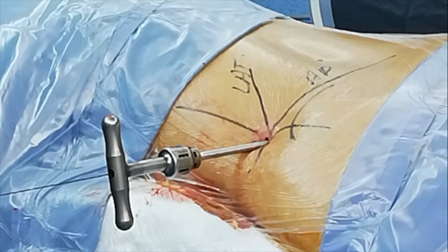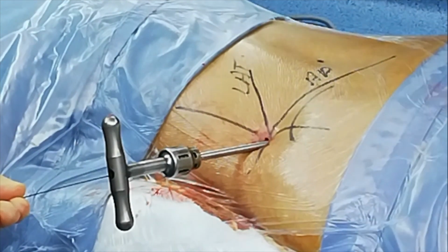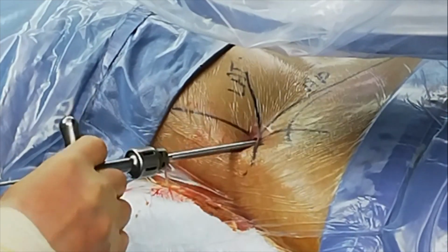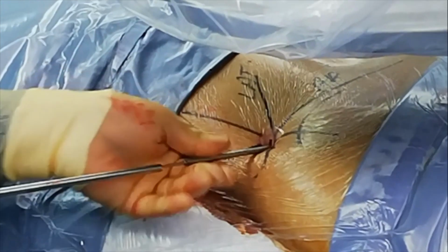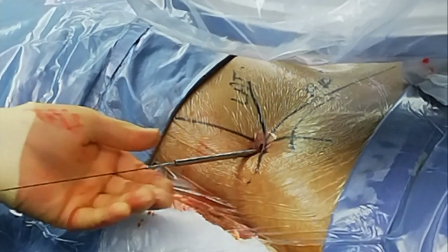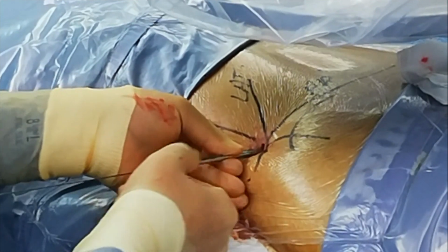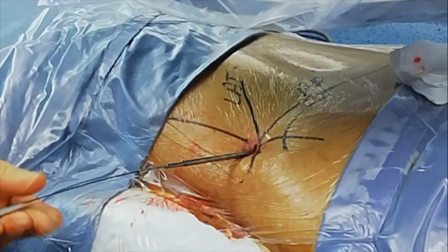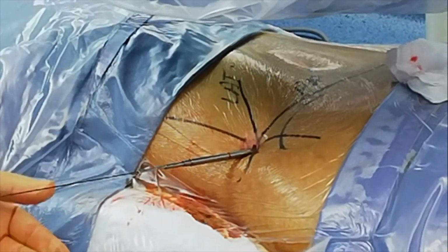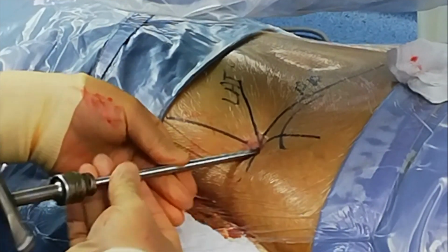We have one more reamer, the big red reamer. So again, I go with the stopping guide, push on it so that the first guide doesn't come out. The yellow reamer comes out, and again remember that I have already reamed for the yellow guiding sleeve, so I have to push it in, and then goes the red sleeve, the last one, and on top of it comes the red reamer, anti-clockwise as I go in.